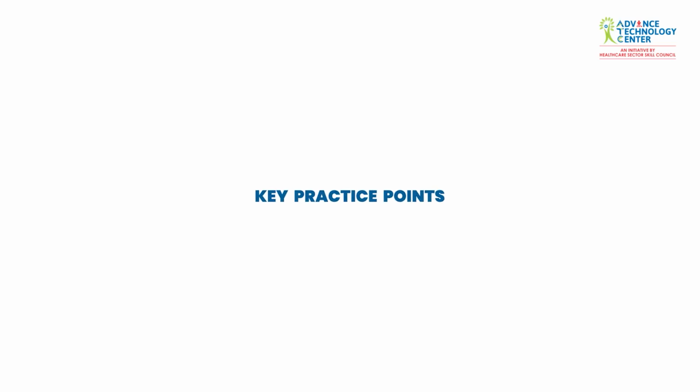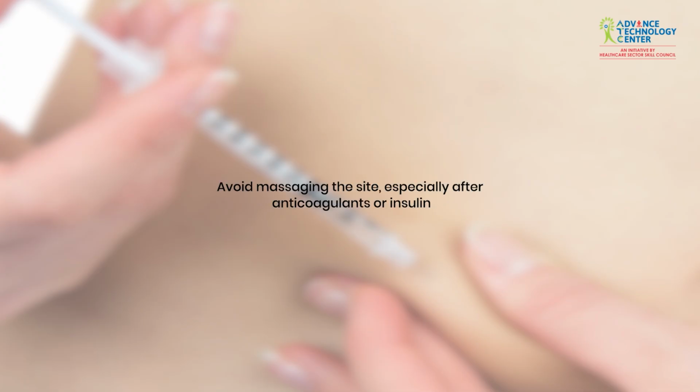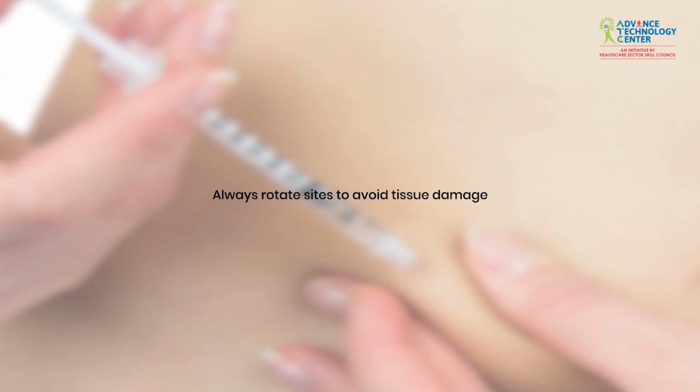Key practice points. Always follow the 10 rights of medication administration to ensure the correct patient, drug, dose, route, time, and safe practice. Avoid massaging the injection site, especially after insulin or anticoagulants, because it can increase bruising or change absorption. Rotate injection sites every time to prevent tissue damage, hard lumps, and poor absorption.